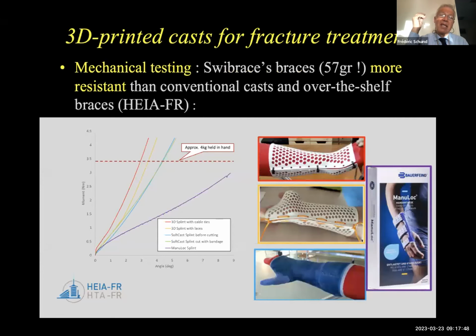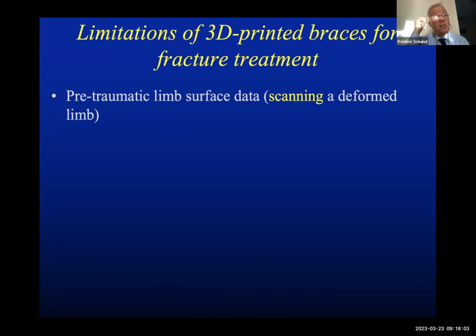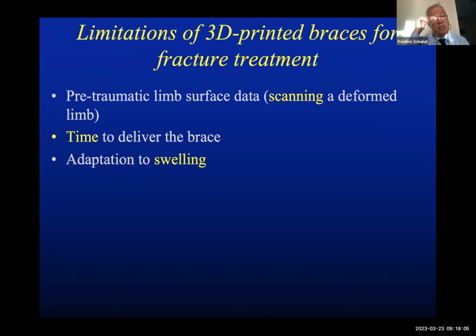We also did mechanical testing of our braces, which are very light, only 57 grams, and our braces are actually more resistant than conventional casts and over-the-shelf braces. But not everything is solved.